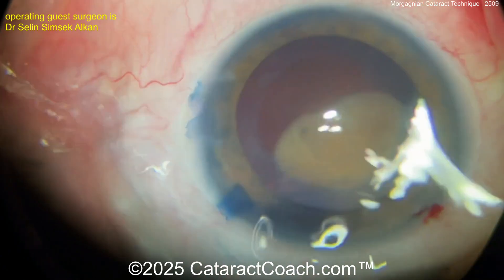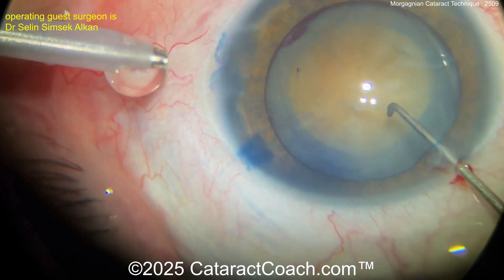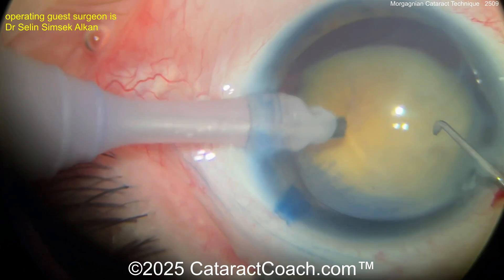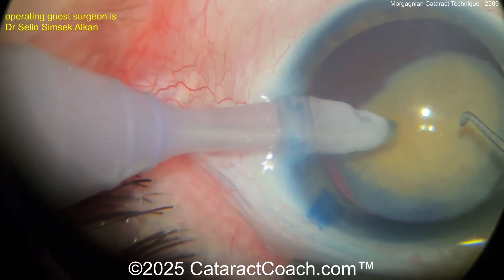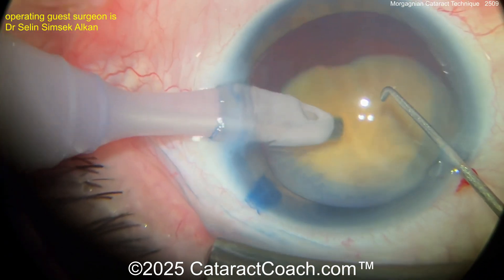Now this nucleus — I'd want to get it up out of the capsular bag. Yeah, push it centrally. I like that idea. The phaco probe is going in the eye now. Maybe some chop technique. I want to get this thing up, up, up — tilt it partially out of the bag if you can.